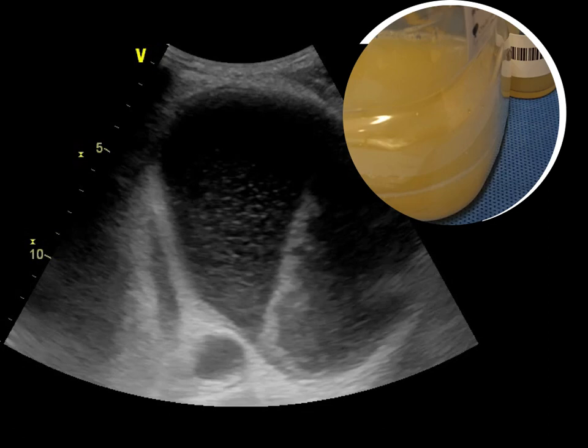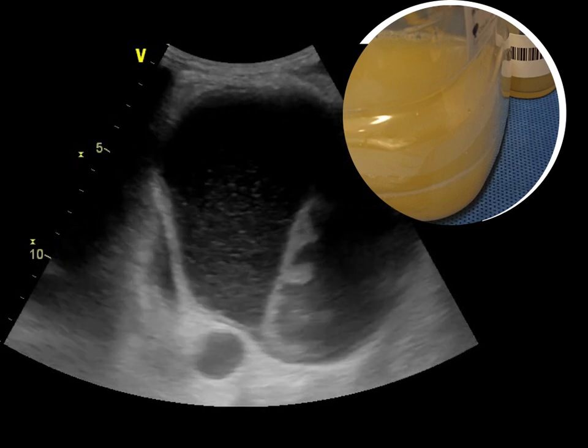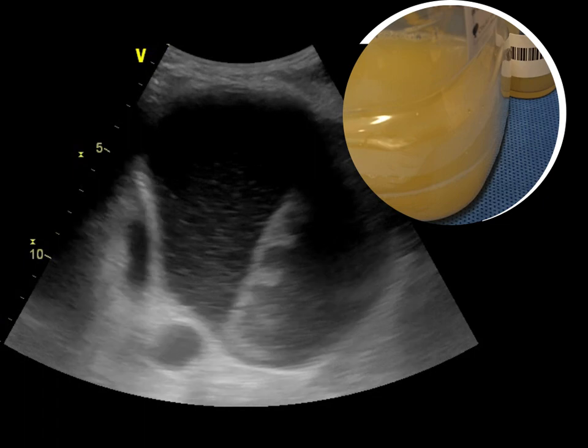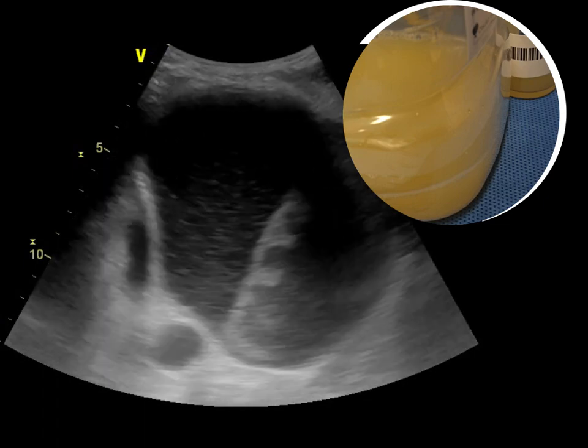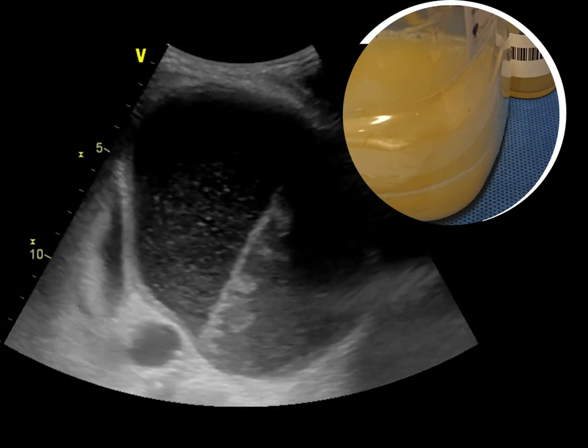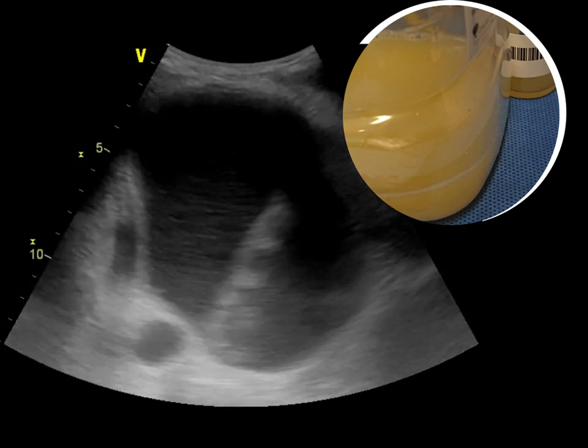This is a short video on how you can identify empyema thoracis from bedside ultrasound. What we normally see is hypoechoic fluid, but as you can see here, there is a little bit of inhomogeneous appearance in a patient who has an abscess.